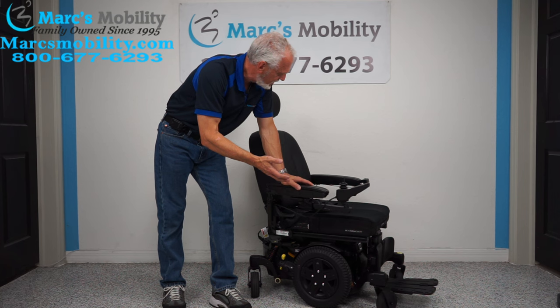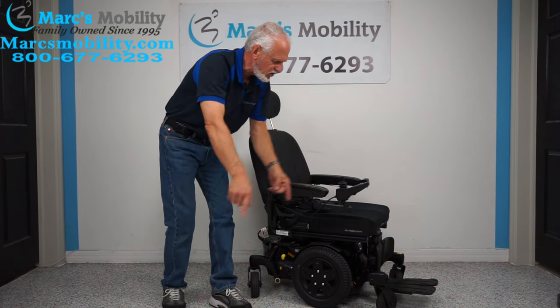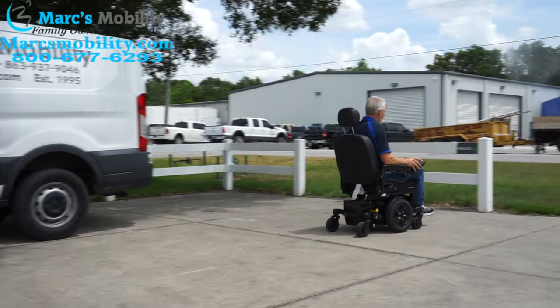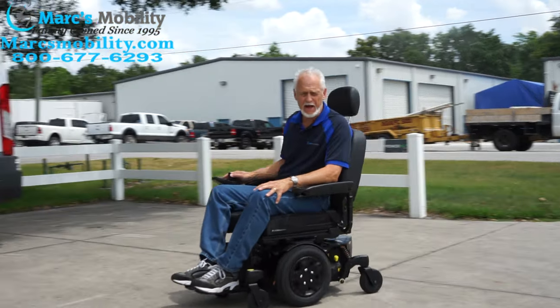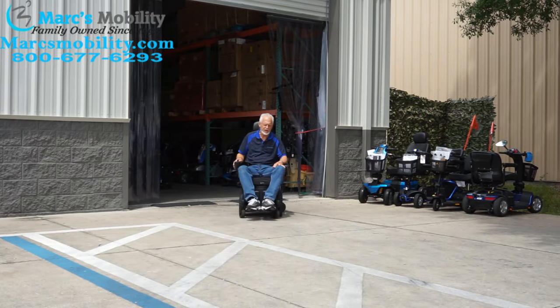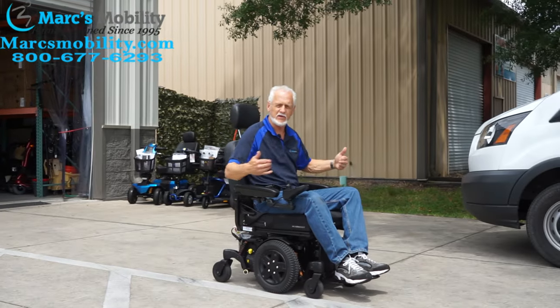So really nice power chair. If you just need a nice large captain's seat with a good turning radius in your home, this one would probably work well. This is the Quantum Stretto. Top speed is about six miles an hour. When you let go of the joystick, it stops automatically — you can see how it comes to a stop.